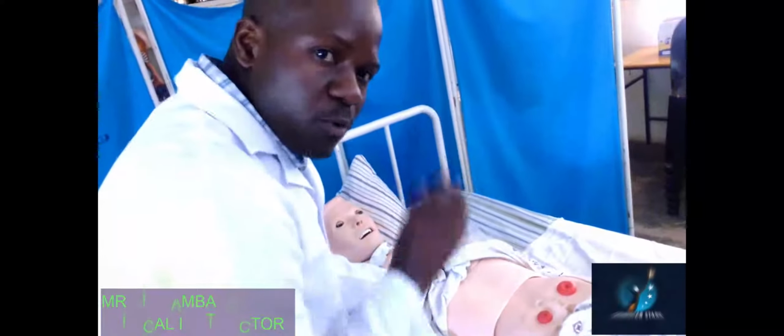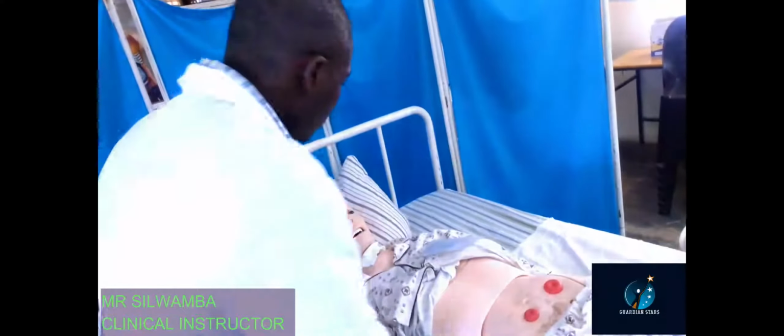So in this case, our patient, Mr. Mwila, has a colostomy here on the descending colon. So this is what we're going to care about. Our care will be focused here because this is where the colostomy is. Those are the parts of the colon, and that's where you are supposed to focus your attention. So he has a colostomy bag.